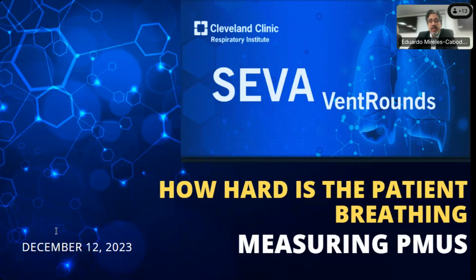Yeah, absolutely. And I also want to highlight another thing that we sometimes hear, and this doesn't necessarily have to be a negative statement. You may have patients in which you want to have the amount of support that they're getting come down. So it depends on the goal of mechanical ventilation or the protocol that you're going to use on how to do that. These types of relationships are just something that you have to be aware of, not necessarily a negative thing, it just depends on how you apply and use it.